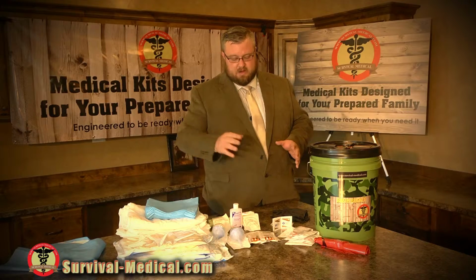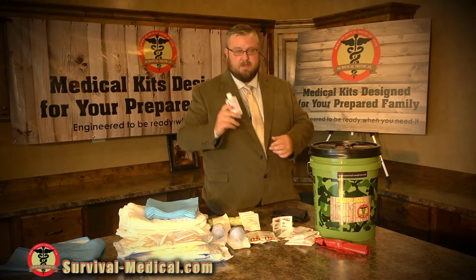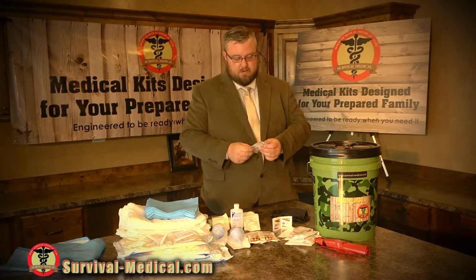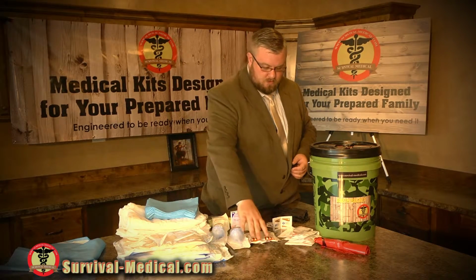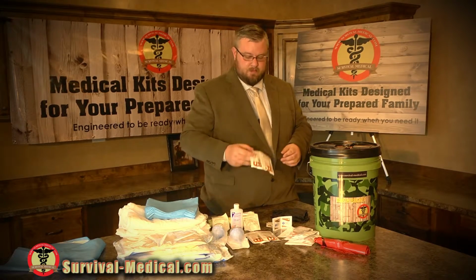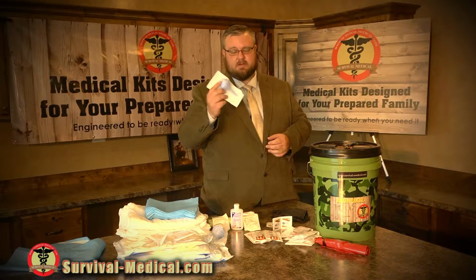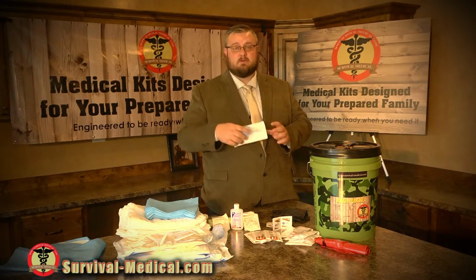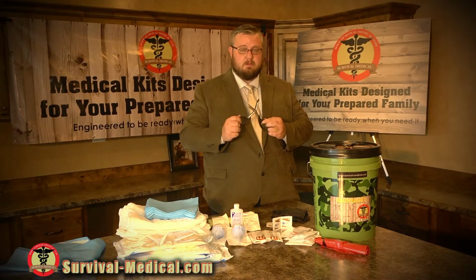Along the sanitation line here, we're going to talk about some of the things we have to keep this process sanitary. We've got some hand sanitizer. We can keep everything washed up and tidy there. We've got some povidone iodine wipes and some betadine swab sticks, okay? Of course, we're all familiar with the bulb syringe, okay? Used to get fluid out of babies' airways, whether that be the mouth or the nose. Okay. We've got some high quality medical shears.